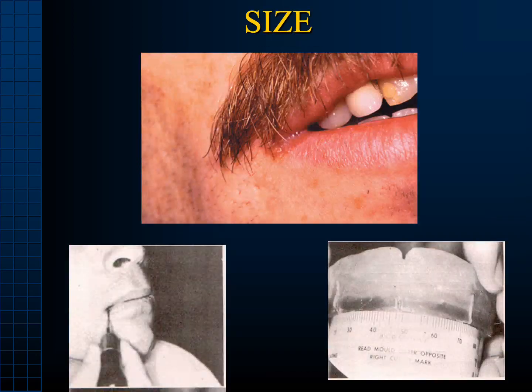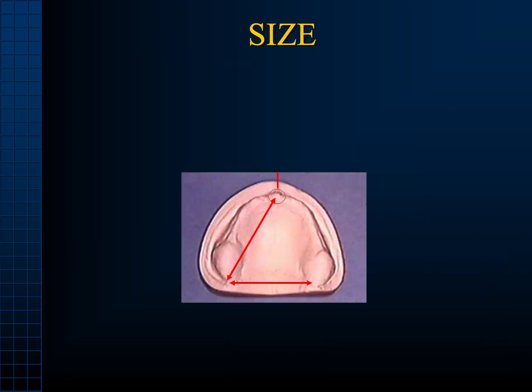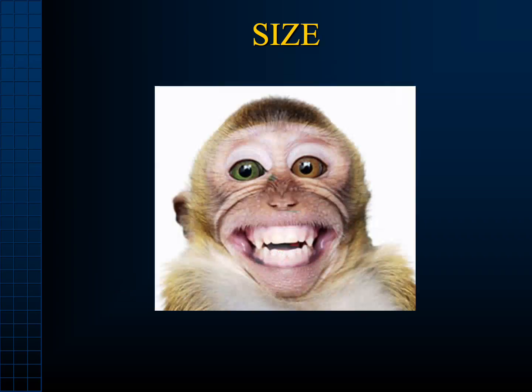The intercanthal distance is another thing which can also be used. The third thing which can be used is the intercommissural width. Intercommissural width, when it is marked on the occlusal rims, we can take a flexible ruler and take the measurement, and that can be used for estimation of the size of the maxillary anterior teeth. The next thing is the measurement from the incisive papilla to the maxillary tuberosity. It forms a triangle, and then that measurement can be used with the help of your flexible ruler for estimation of size of all the upper teeth, both anterior and posterior.